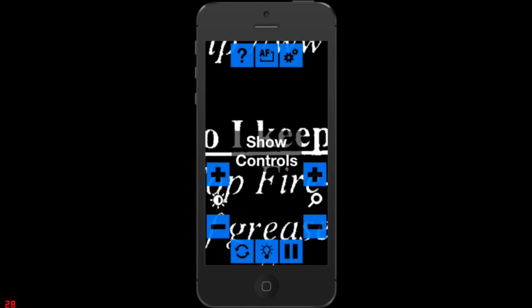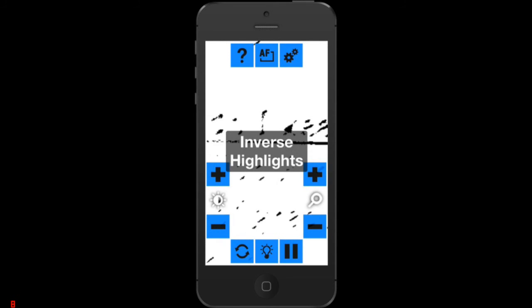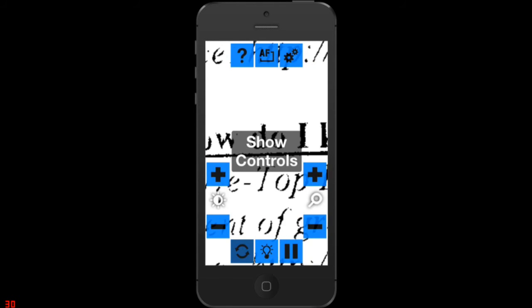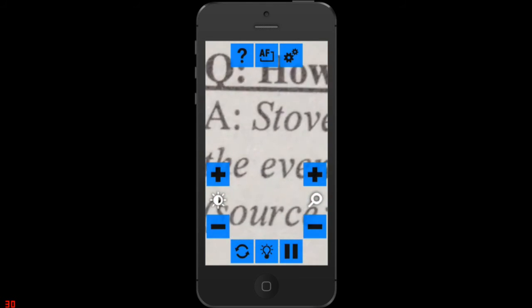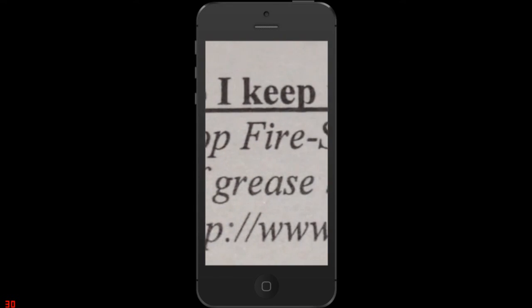Now when I'm on full color. Oh, wait, no, hold on. No, let me see. There's full color. So when you're doing the full color thing, you'll get a little bit of blurring, but it's not near as bad. It doesn't flicker near as much.